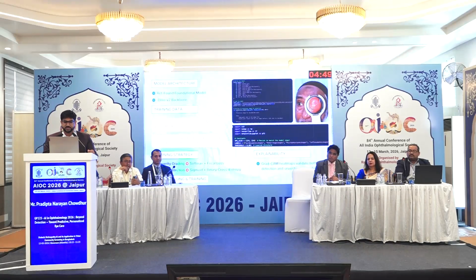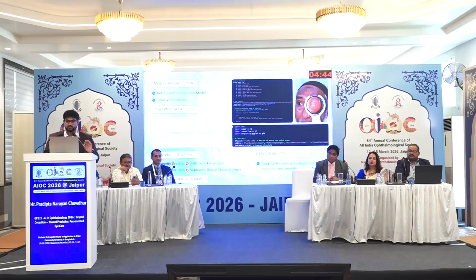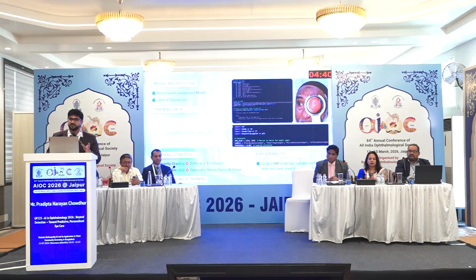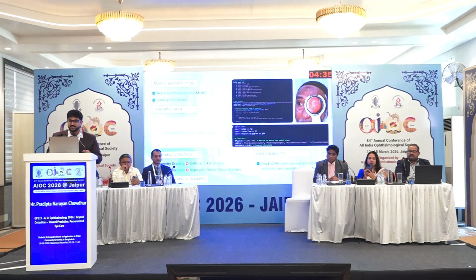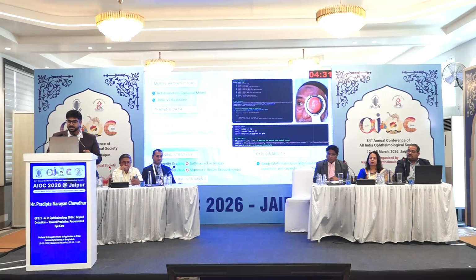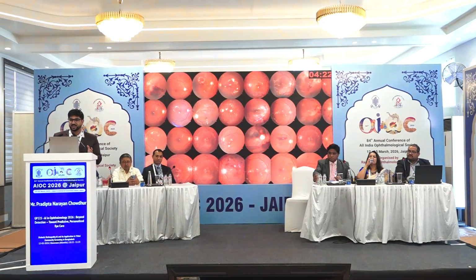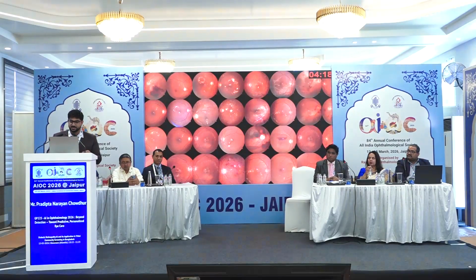As for the model architecture, we used the RETFound foundational model, which is one of the topmost ophthalmic models, built by Moorfields Eye Hospital. We fine-tuned it with the Bangladesh eye dataset. We had around 63,000 hospital images that we used to train our AI. And we made sure to have Grad-CAM explainability, because if the AI just gives a diagnosis, it doesn't help. The doctor needs to know where the AI is coming from. That's why we use Grad-CAM explainability.